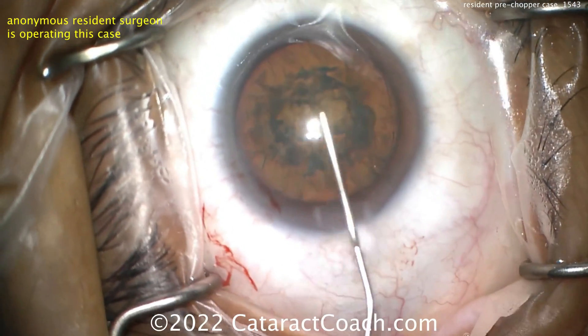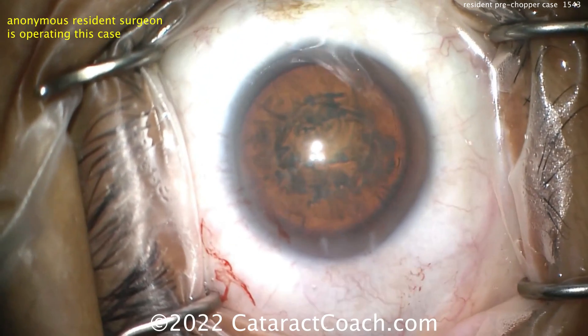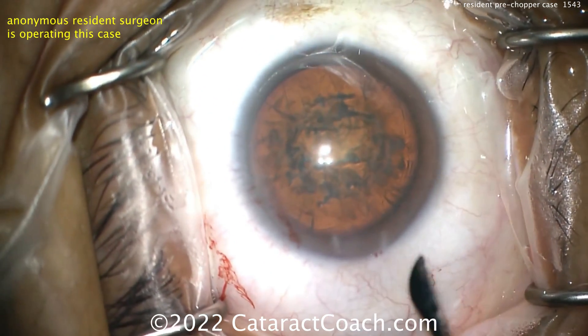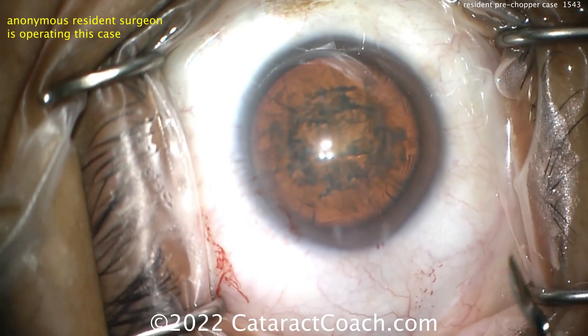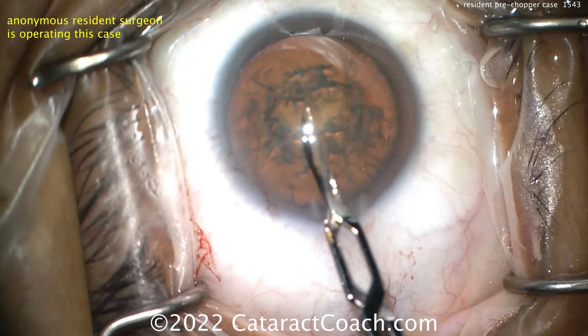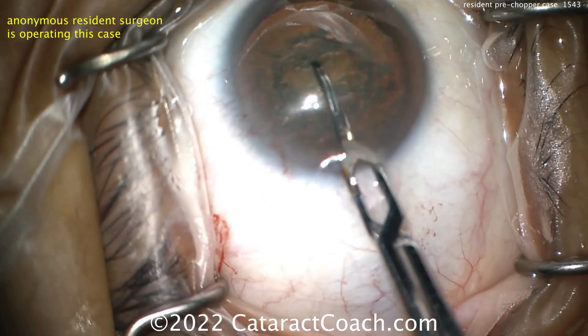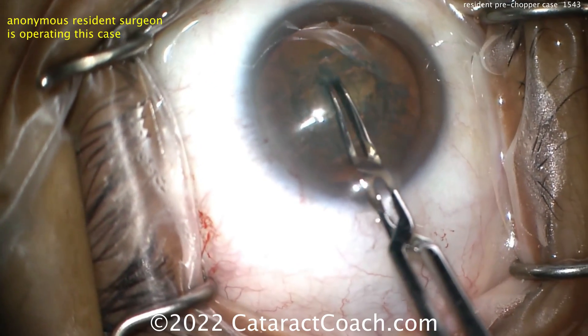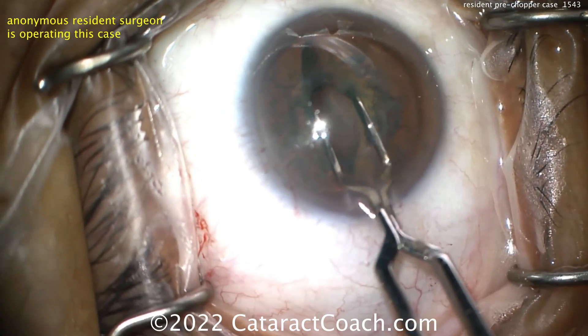More viscoelastic is needed for the pre-chopper because you now need to have the eye refilled. Here comes the pre-chopper going inside the eye. You can see it has these two paddles — it's relatively sharp, sharp enough to penetrate into the nucleus. With a lens of this density, you don't have to necessarily hold the lens in place.